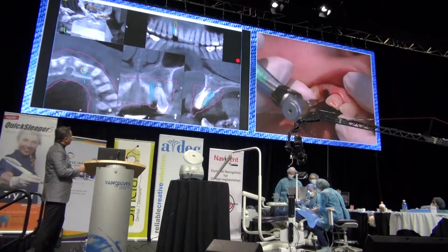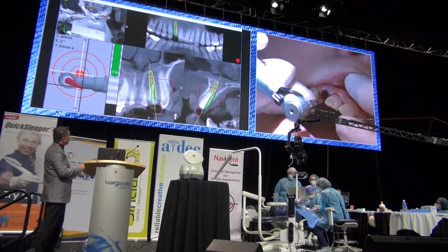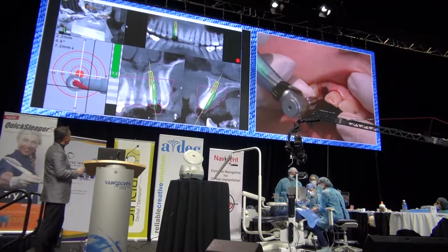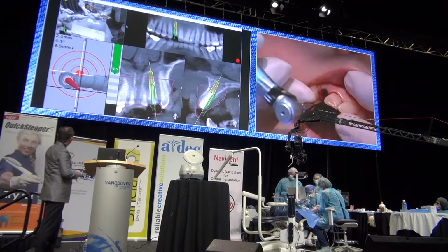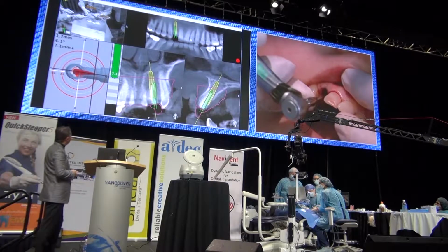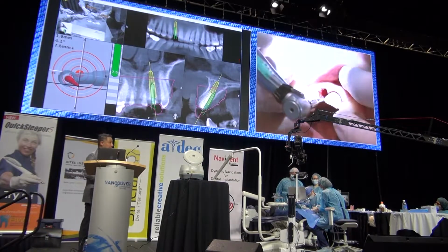We can see the shape of the root. Again, we're not going to follow the apex. We're going to be slightly palatal, and we have available anatomy and bone to engage as required in that area. So most of us, when we're doing the surgery, will be looking at this to get the angulation and position. With a healed osteotomy with good bone, it's easier.